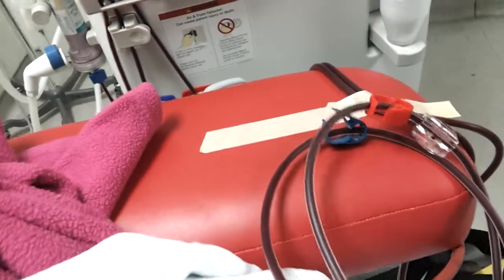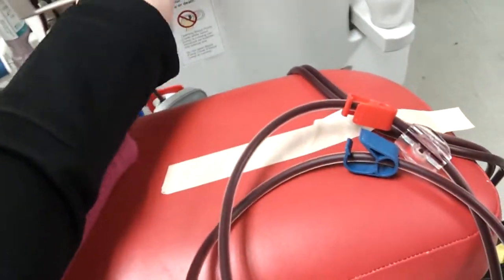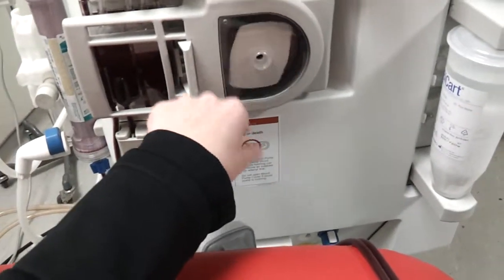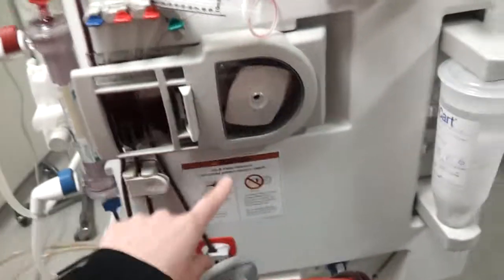So what's happening is the blood's coming out of the arterial side from my body, and it's going through all these tubes and into this chamber and through this pump. And this pump helps increase the blood flow, so how fast the blood's actually going through my body or coming out of my body, and how fast the blood's being cleaned. So that's what dialysis is for.